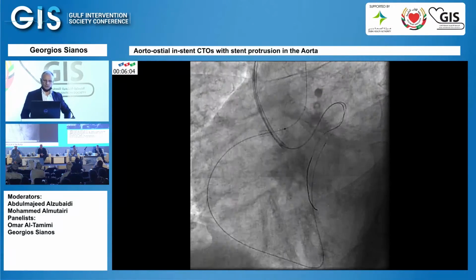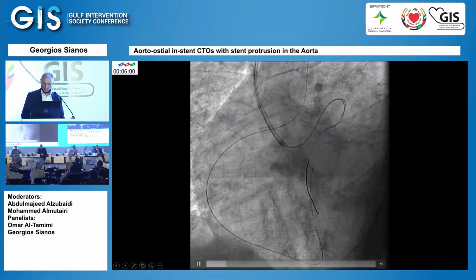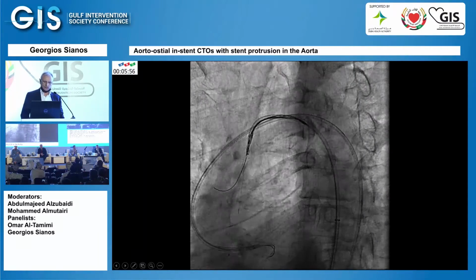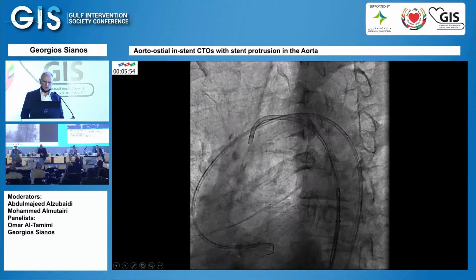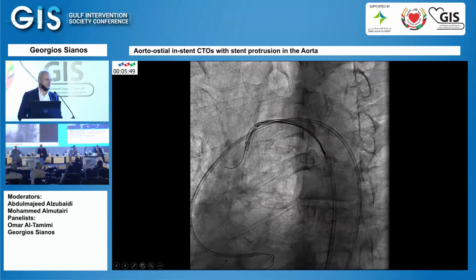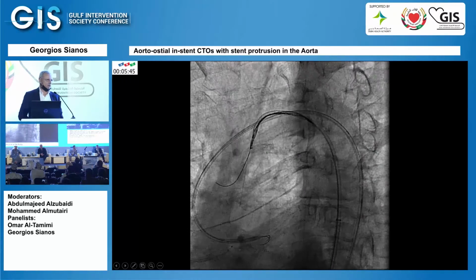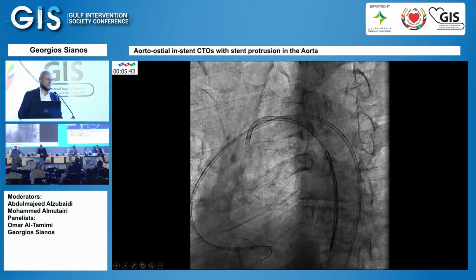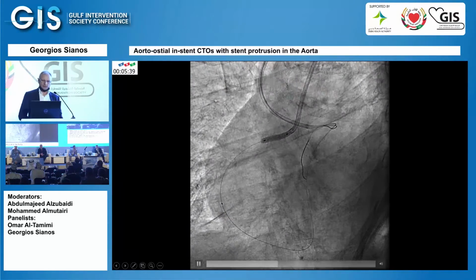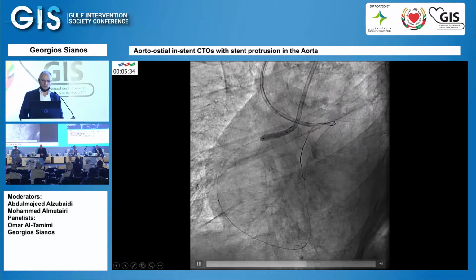At this time point, there is not yet an antegrade guiding catheter. So what we did is that we used an endovascular snare, and you see here that we grabbed the retrograde wire. One key point here is that you never snare short wires. You should snare long wires. This was an RG3 330. Despite the fact that the lesion was crossed with a Sion wire, the wire was externalized, and what is important afterwards is that the case is getting on the good track.